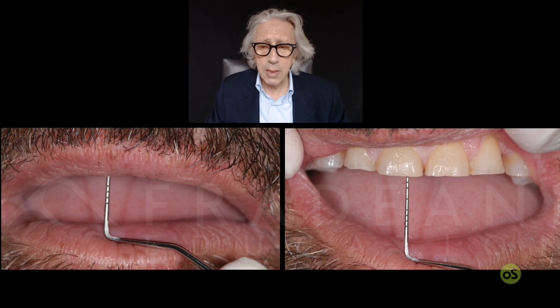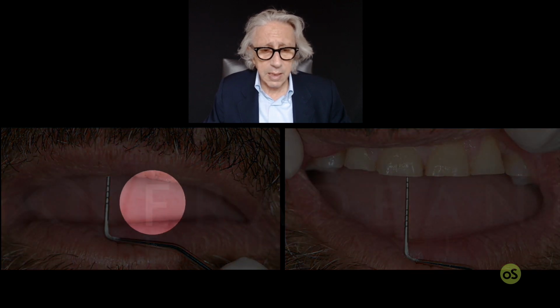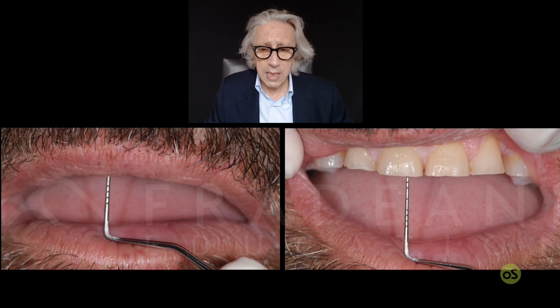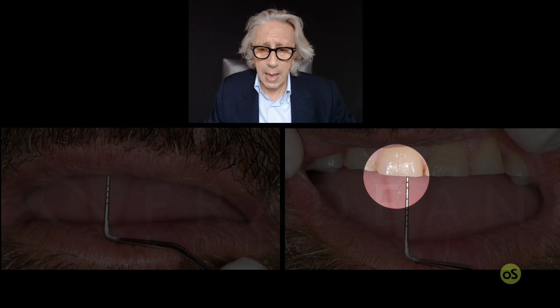In the meantime, I said the rest position. Rest position is something very useful because, as you know, a man at that age, in his 50s, should show maybe not 3 millimeters like a young woman, but at least 0.5 to 1 millimeter of central incisal edge at the rest position. But in this case, you are at -5. As you can understand from this picture here, you are at -5. It means that the incisal edge is 5 millimeters underneath the upper lip.